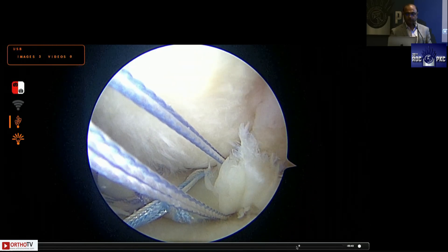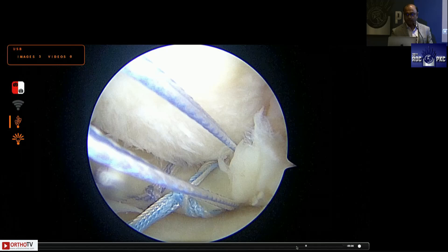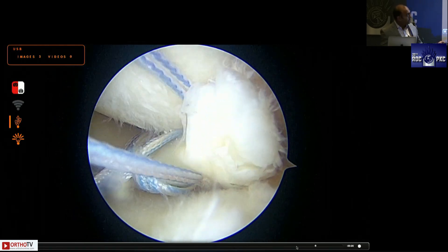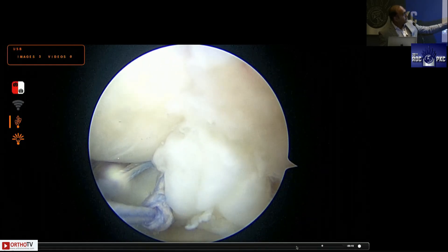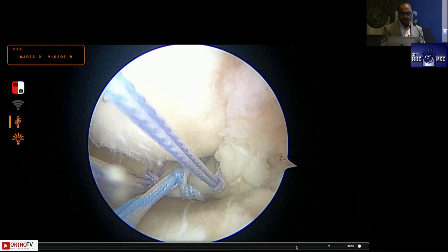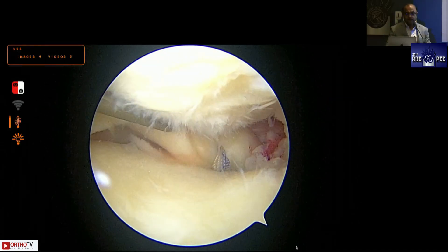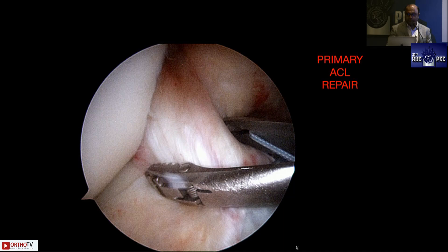I don't discard that zero number fiber wire — I take it through the tissue near the root, which is not of great quality, and secure it with a double looped construct. What works very well is the tensioning sequence on the tibial side over an ABS button: tension the first suture through the best quality tissue first, then the next suture, and finally the last, reducing the chances of ripping off. The loop portion enters into the tunnel — I like that there is a broader surface for healing, and you want the loop to enter into that tunnel.